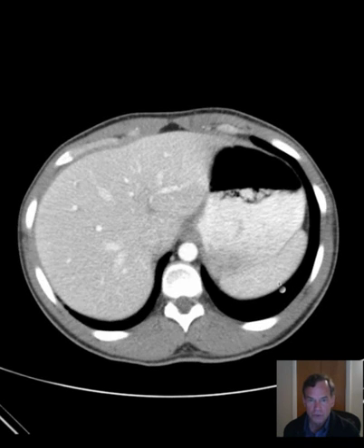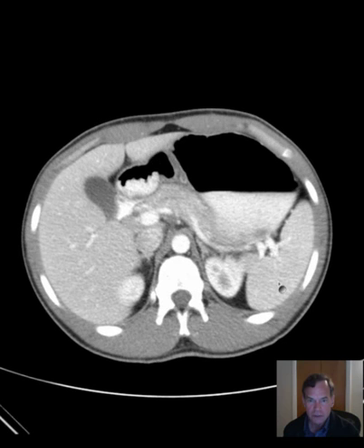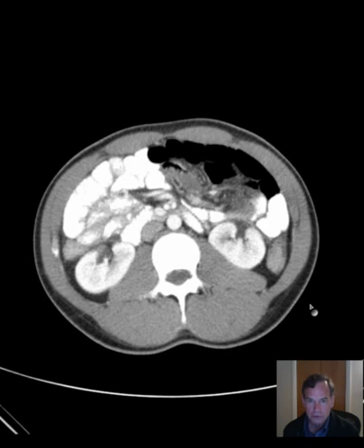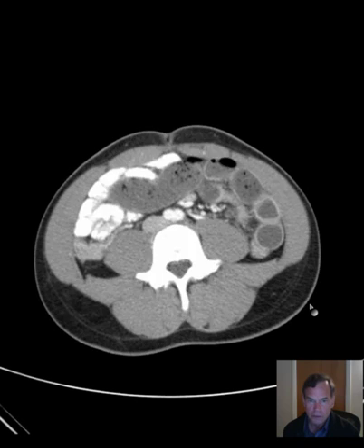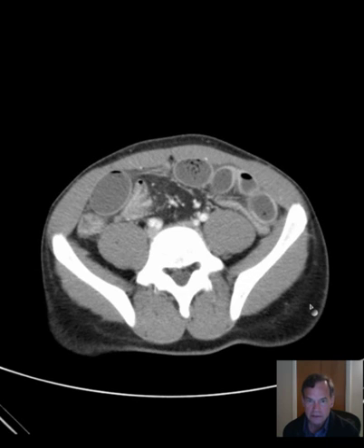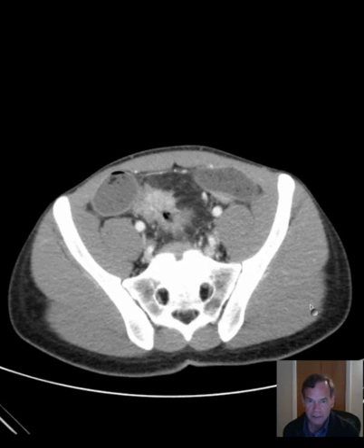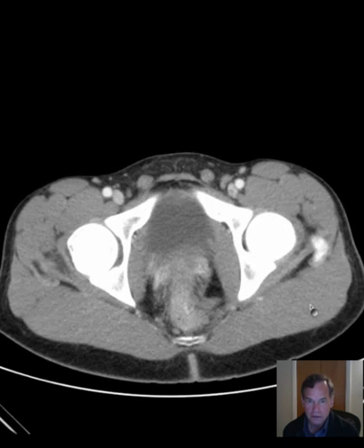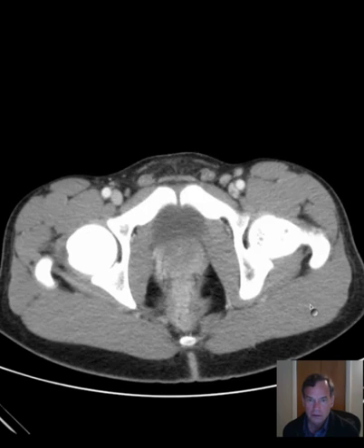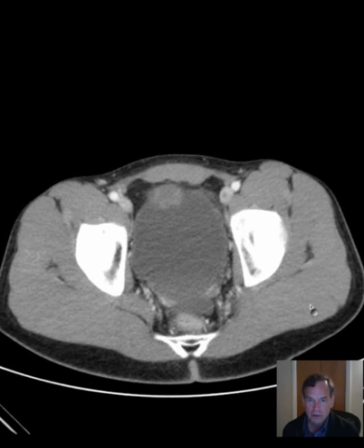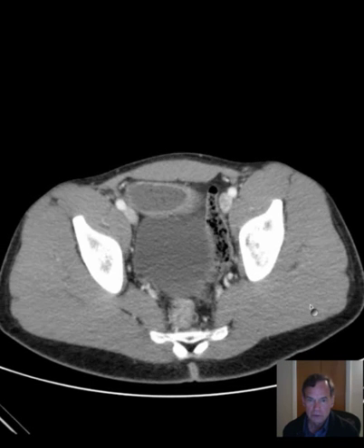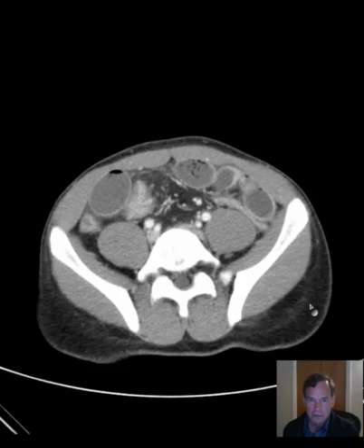I'll scroll through these axial images, give you a chance to get an overall view of what exactly is happening here. Maybe something catches your eye. And then we will go back up.